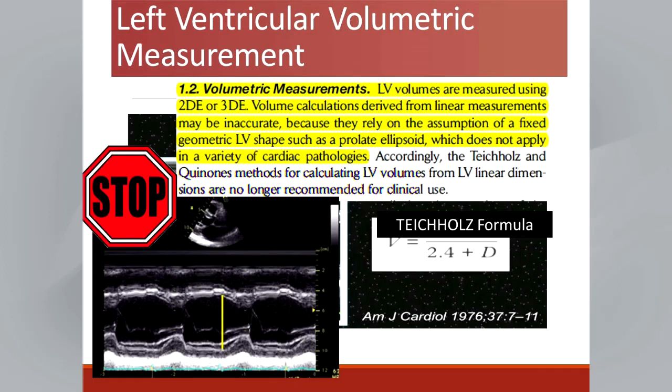Regarding the volumetric measurements, these, of course, can be obtained either from linear measurements, from 2D echo, or from 3D echo. The committee comes strongly from the point of view that when you want to obtain volumes from linear measurements, that should not be performed.